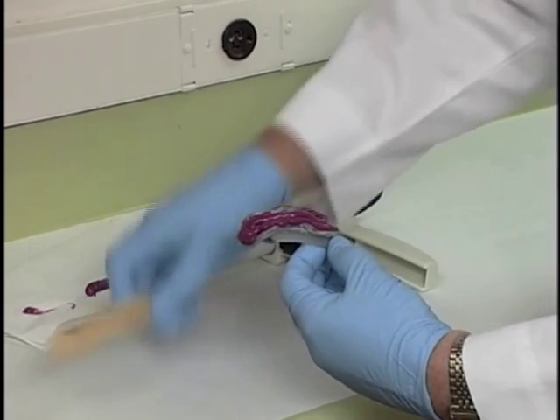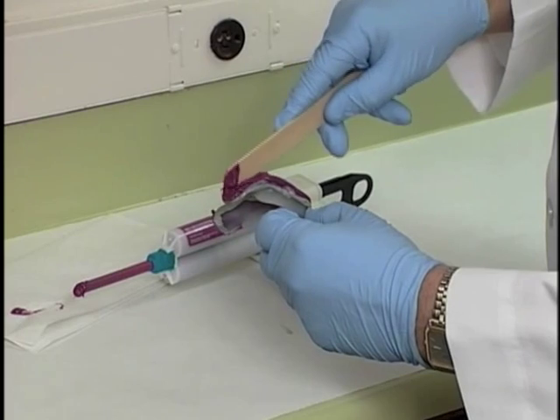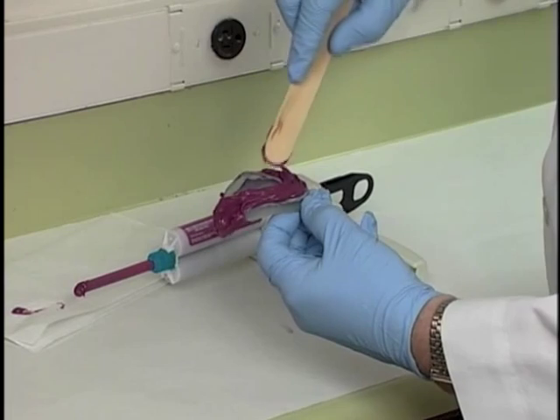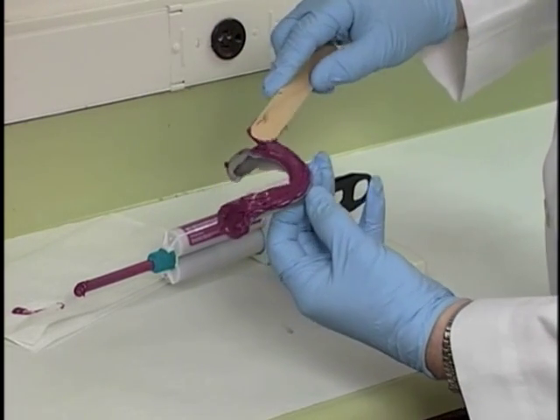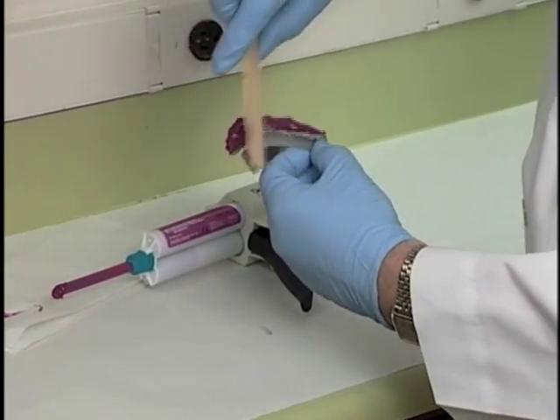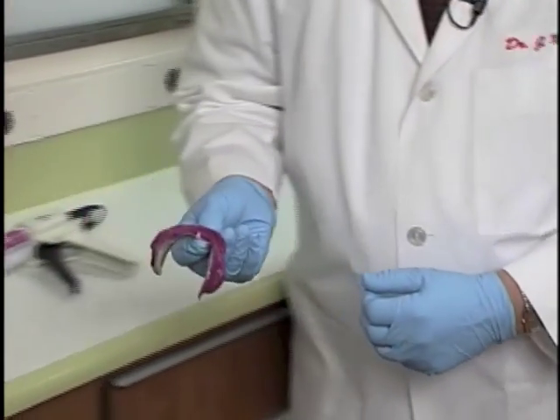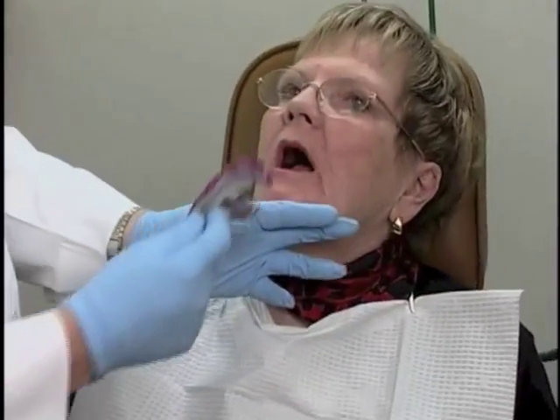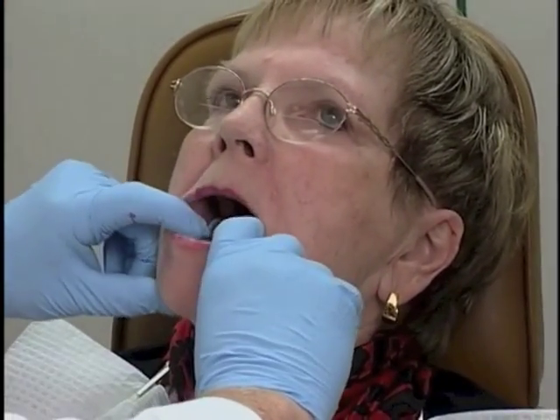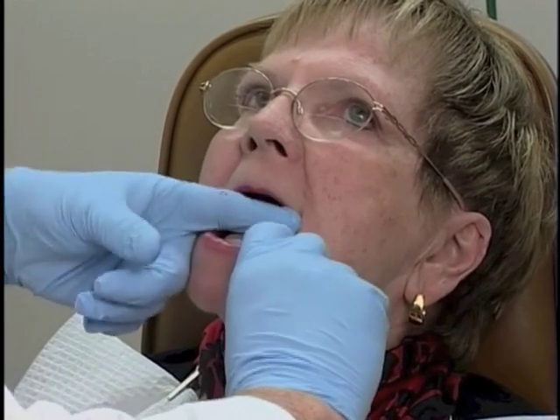Once we have the material in the tray, take a tongue blade and spread the material, making sure we get it up onto the peripheries nicely. And once the material is spread onto the tray, we're ready to go to the mouth. And we rotate the tray into the mouth. Put your tongue out at me, please. Now relax the tongue, and we're going to seat it.